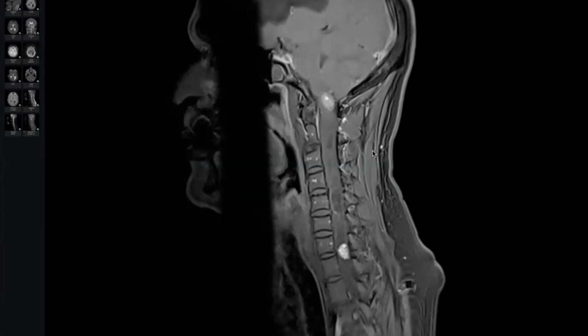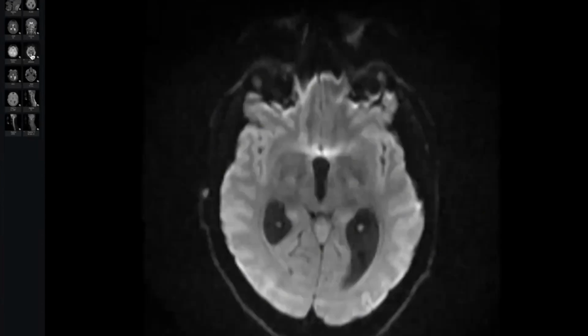Doctor, do you want to have a look at the brain in post contrast? Yes, sir, please. But why didn't you ask? The examiner will not ask you. See, Michael. Okay. It will be one bad experience for me.